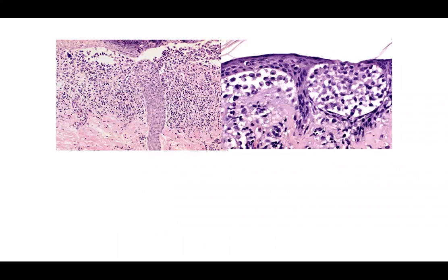Inflammatory or neoplastic? On the left you may struggle to determine if this is lichenoid inflammation with Max-Joseph spaces. Some cells look large with abundant cytoplasm. On the right you see what appear to be Langerhans cell microabscesses, which can occur in a spongiotic contact dermatitis.